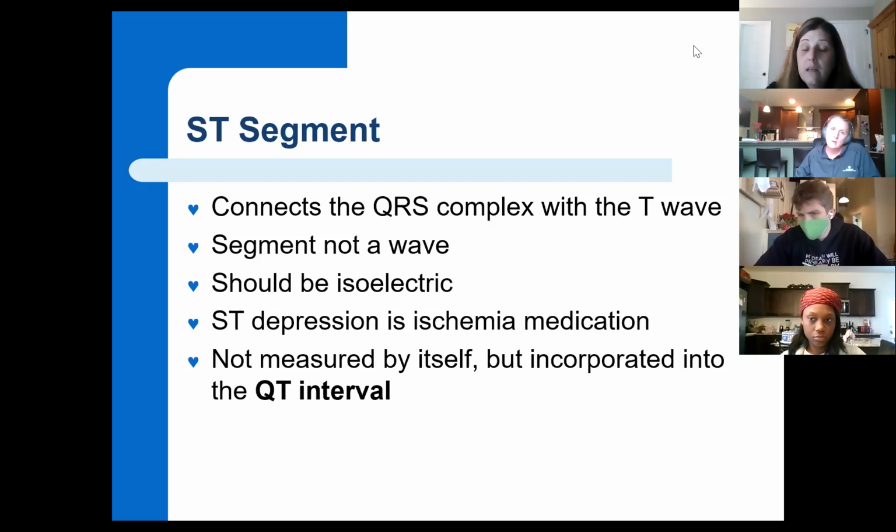Now, I'm going to say that a lot of times students say the weekly strips are hard to read. Do not worry. On the test, they are so much more clear, okay? We've never had anyone say that the strips on the test are hard to read or hard to count. We understand the ones that we use on the weekly math EKG sometimes are a little bit fuzzy or maybe a little bit grainy. Do not stress. The ones on the test will be nice and clear for you.